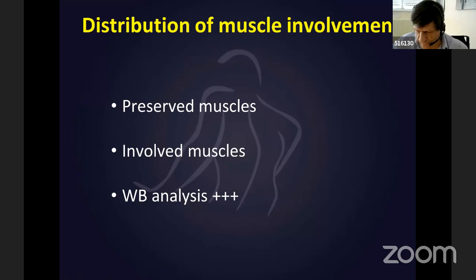While abnormalities may be very recognizable in lower limbs for some of the myopathy, others need scanning distant regions of the body to find more conclusive features, and therefore all body scanning technique will often be more contributive. This is the case for most congenital myopathy, in particular those presenting with mutation in selenoprotein, dynamin 2, ACTA1, and nebulin myopathy.